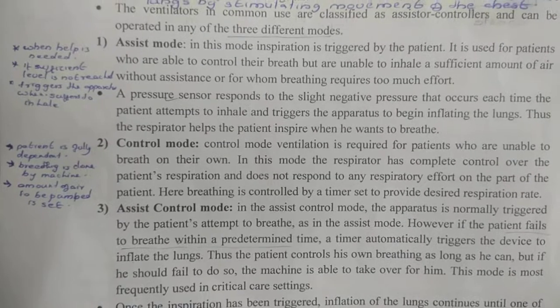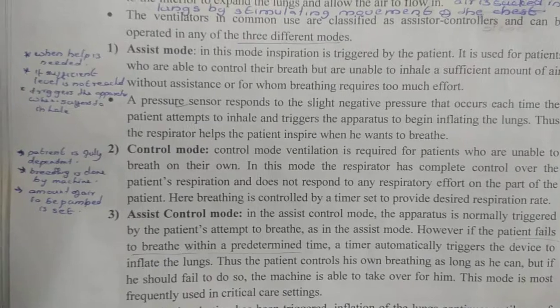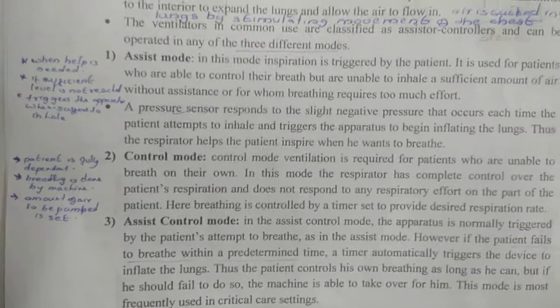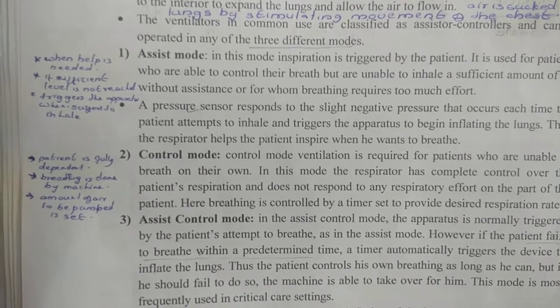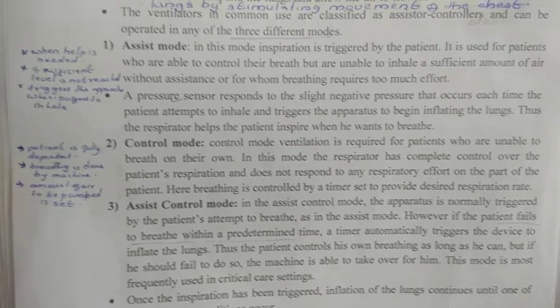That is, when an insufficient level of air is seen, then the trigger is given to the apparatus and the apparatus starts working, or it assists whenever the requirement is there. That process is known as assist mode. It does not function always.